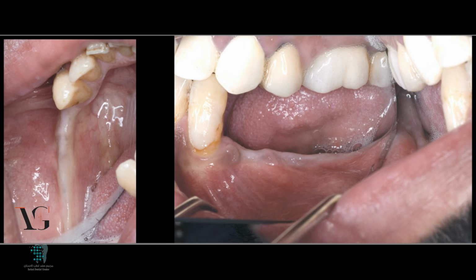Here, in this case, for example, it's a young guy who came with an edentulous area in the posterior part. We can see on the left side of the photo that we have this ridge with a narrow band of keratinized tissue. You can see the area, and as well on the buccal view, if we give it a thickness, it is only around 1 or 2 millimeters, that diminishes into very little amount in the posterior or distal area.